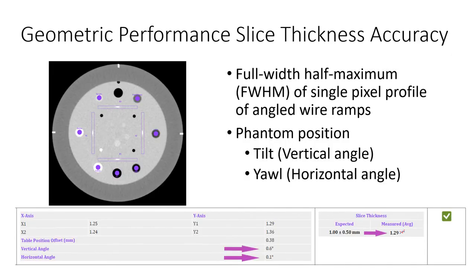Slice thickness accuracy is evaluated as a full width half maximum of a single pixel profile of each wire ramp, corrected by the tangent of the ramp angle. The profile is constructed based on the maximum pixel value found over the length of the ramp, sampling across a limited distance perpendicular to the ramp.